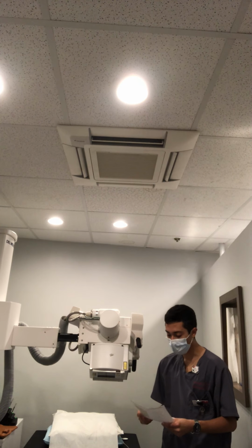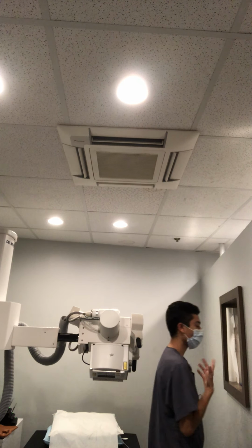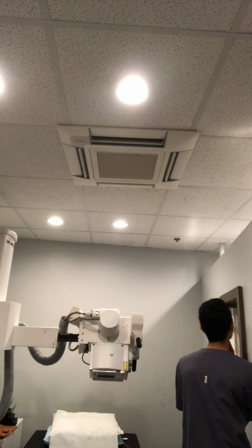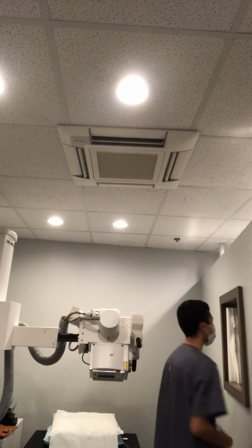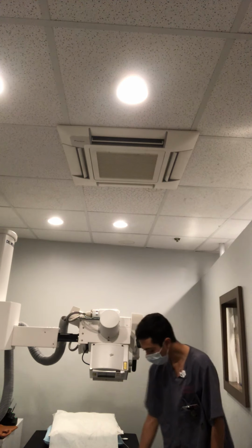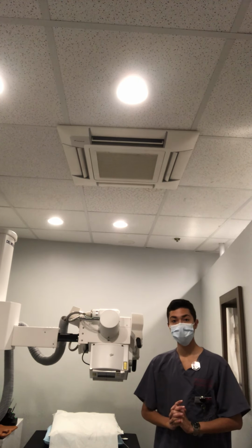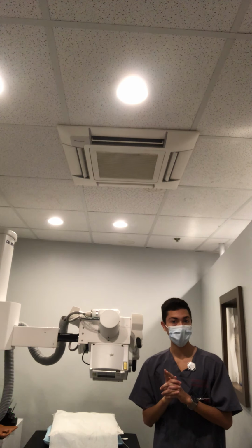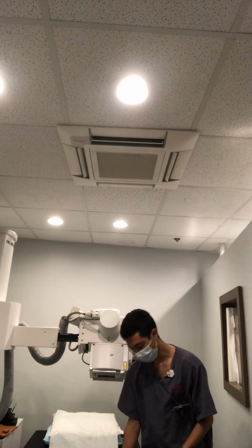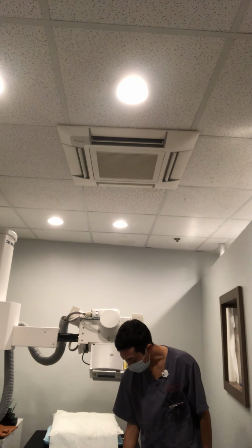Table bucky or vertical bucky. You can actually do it erect, the same way you would do it prone. You just got to make sure it's in a true lateral and their head is turned a little bit. It may be uncomfortable for the patient, so that's why you would set everything up first. AP or PA. So the textbook says you have to do it in a semi-prone, but you can do it in erect, if patient condition permits. Other optional, erect.